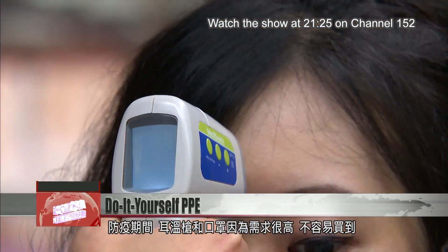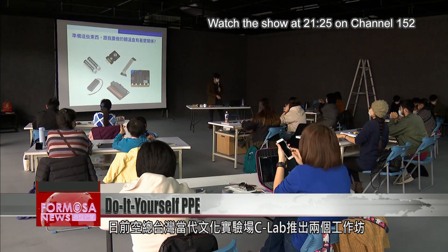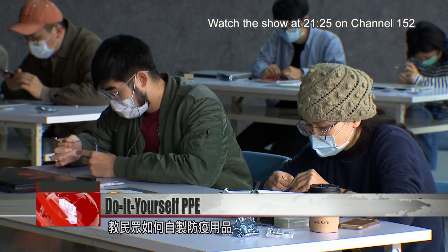Thermometers and face masks are in high demand and can be hard to find. In April, the Taiwan Contemporary Culture Lab, or CLAB, held two free workshops to teach people how to make their own personal protection equipment.